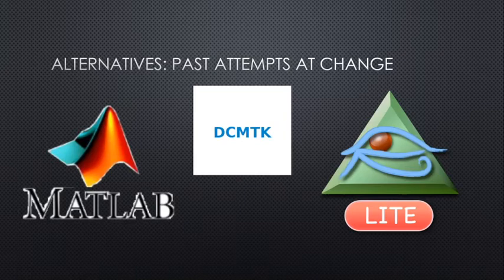There are randomizers that change the PIDs, and they also change the patient names, but doing something as complex as reading the DICOM header and deciding where each consecutive series that hits the program should be associated with is going to take quite a bit more research and coding time.